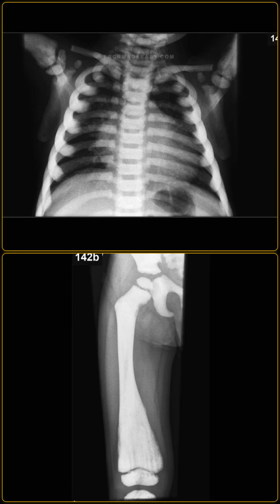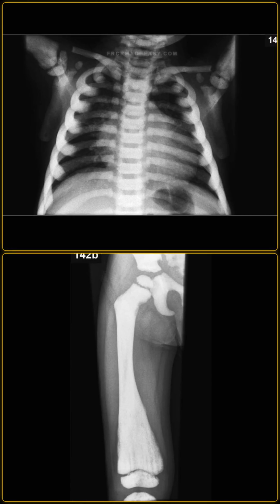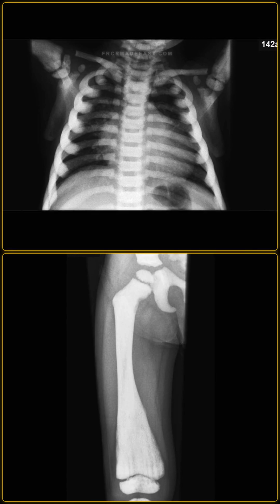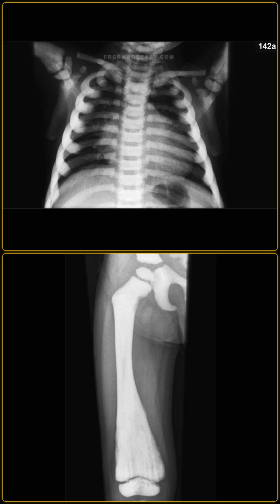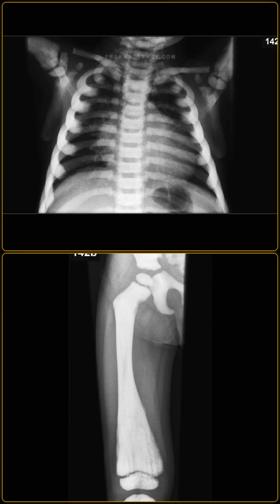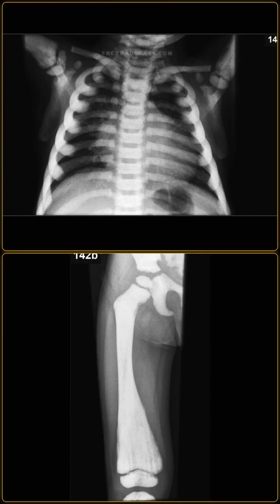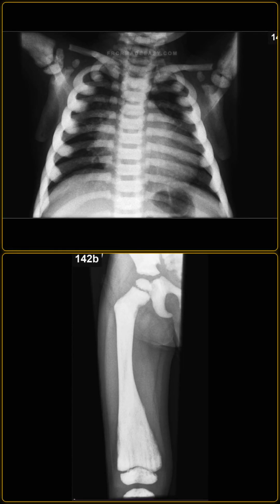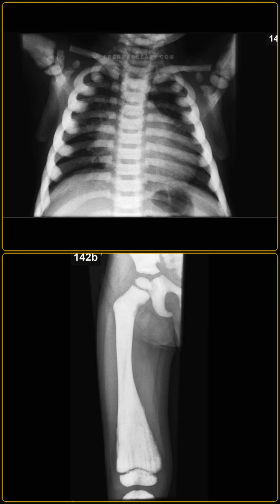What other classical skeletal manifestations are associated with osteopetrosis, and how would you manage this patient as a radiologist? Classic plain radiograph signs include a bone-within-bone appearance in the vertebrae or phalanges, and sandwich vertebrae showing sclerotic end plates. For the infantile recessive form, bone marrow transplantation is the only curative therapy to restore normal osteoclast function.